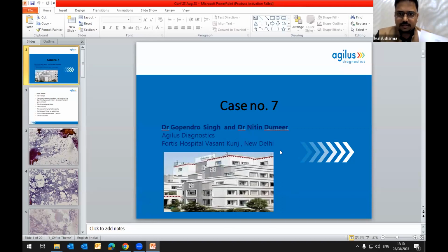And the other thing, another very, very important fact, is that not always a follicular lymphoma will show you a follicular pattern. We need to understand that there could be a mix of follicular and diffuse patterns. There could be diffuse patterns of follicular lymphoma, and they are not characterized as DLBCLs. I mean, a more aggressive biology versus patterns, these are different things. And grading is a completely separate entity, which will depend upon the number of centroblasts which are present or not.